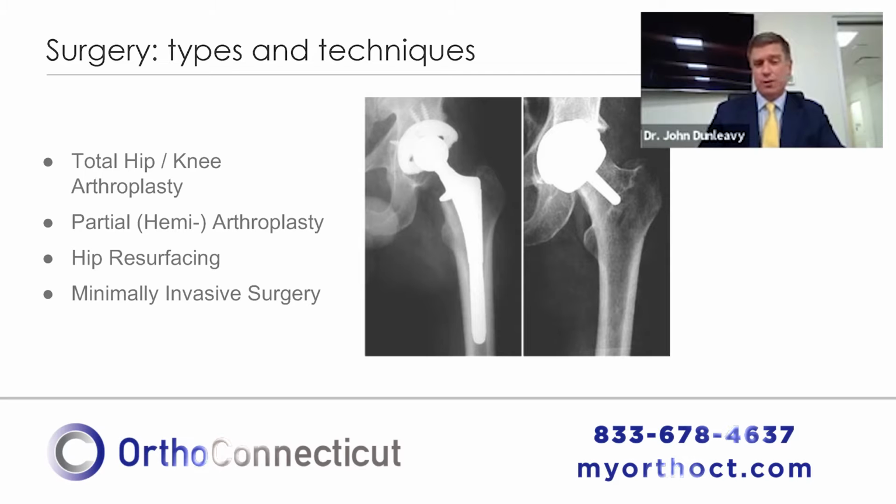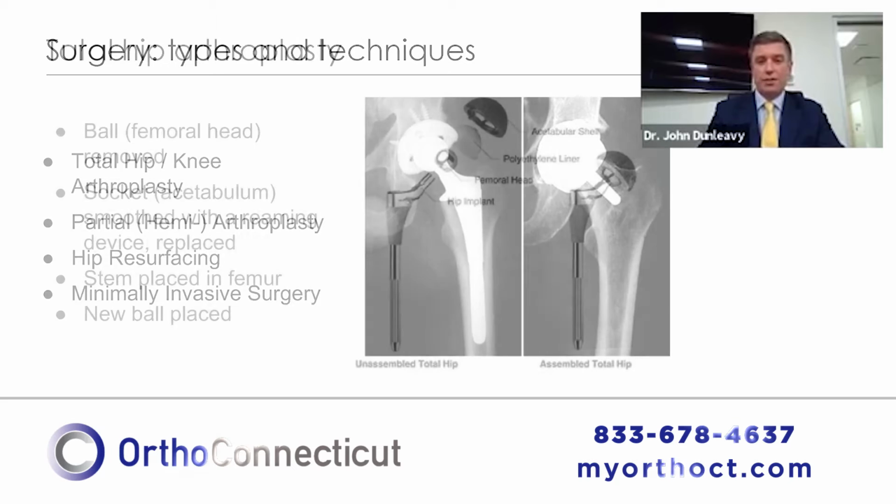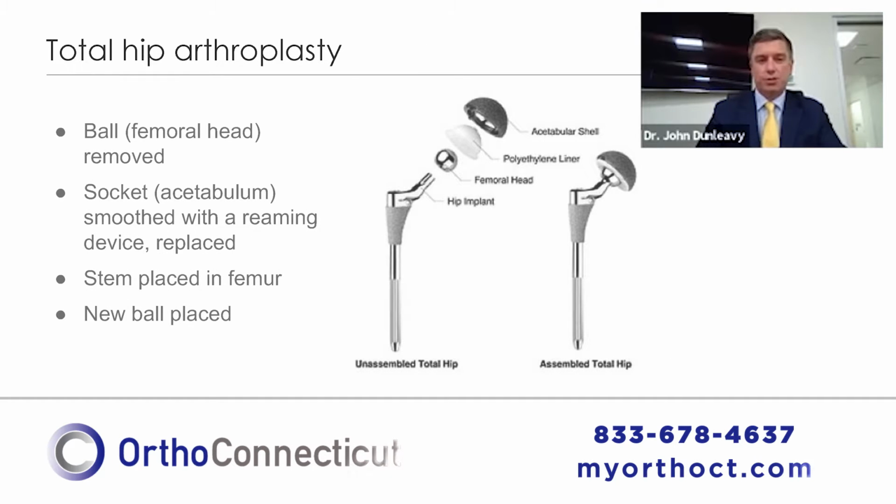The surgery, there are different techniques involved. First of all, there are total replacements, there are partial replacements, there are other things with a hip called hip resurfacing surgeries, and there are different techniques such as minimally invasive surgery. Total hip replacement refers to a surgery where the entire hip joint, ball and socket, are being redone.